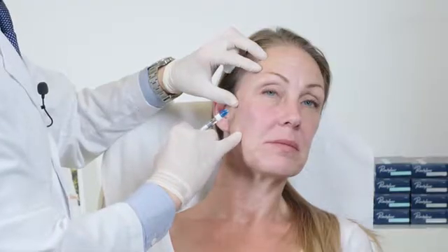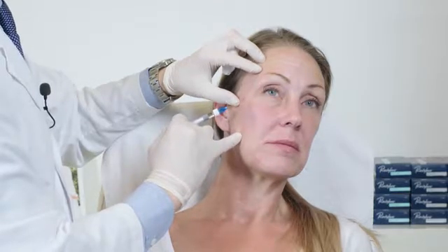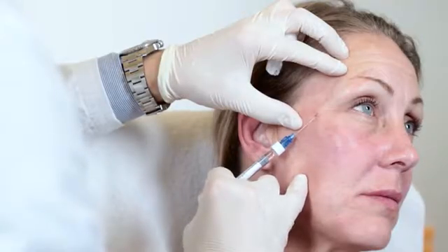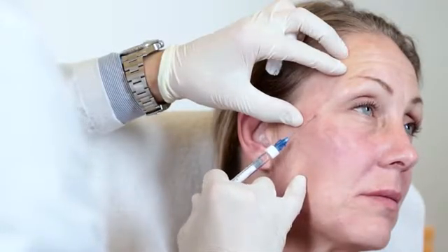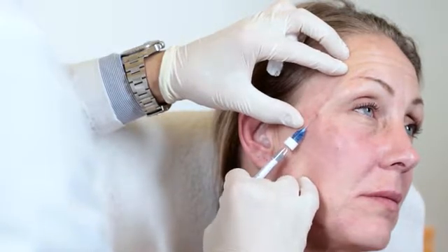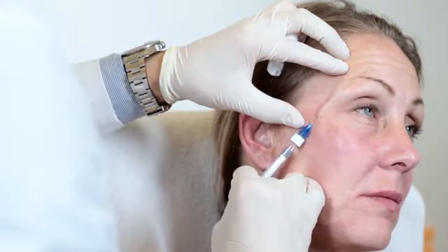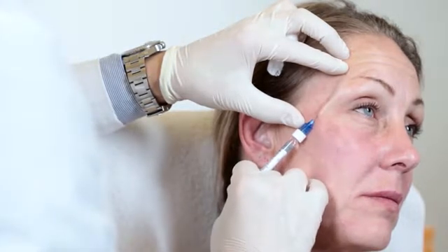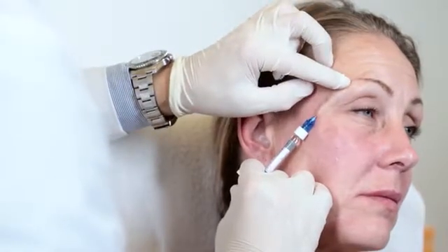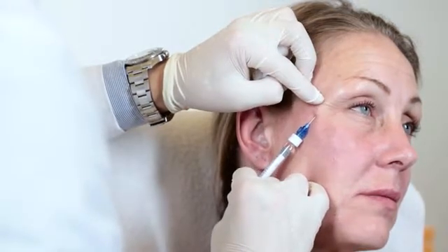For a finishing touch, I will elevate the lateral aspect of Emmy's brow using Restylane and a cannula underneath the orbicularis oculi muscle. I slowly forward the needle as I inject and watch the tissue lift. Very small quantities go a long way in this area, and I aim at injecting from the frontal ridge along the outer orbital rim until the upper border of the zygoma.